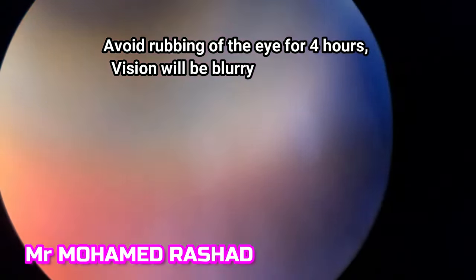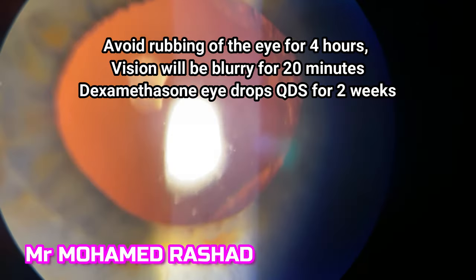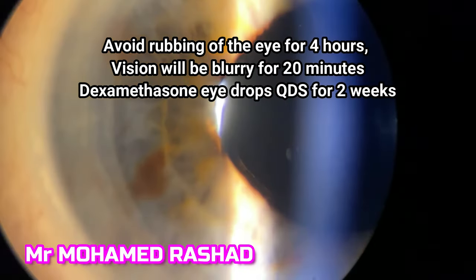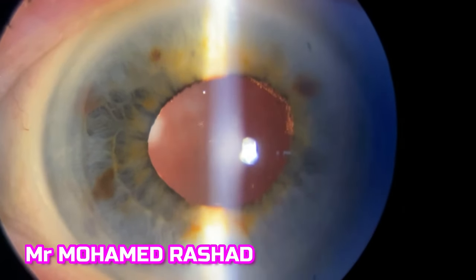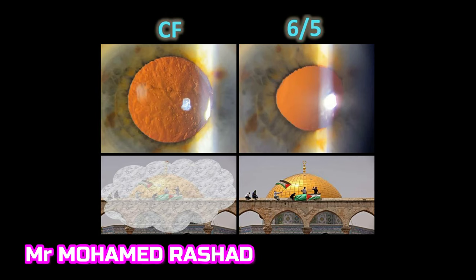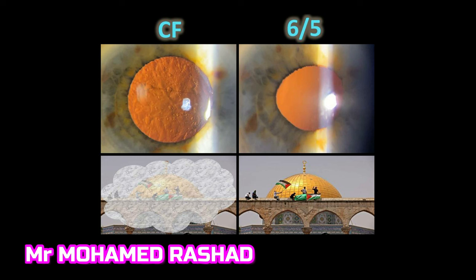Use iodopine after the laser — one drop of apraclonidine. Instruct the patient to avoid rubbing their eyes for about four hours. The vision will be blurry for 20 minutes after the laser and then will come back. I usually use dexamethasone eye drops four times per day for two weeks. This is the before and after: the vision on the left was counting fingers before the laser; after the laser the vision is 6/5 and the patient is happy with their clear vision.